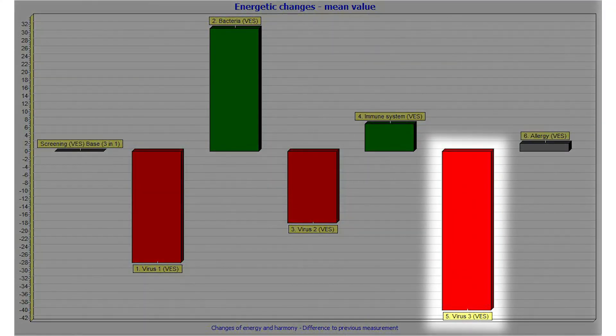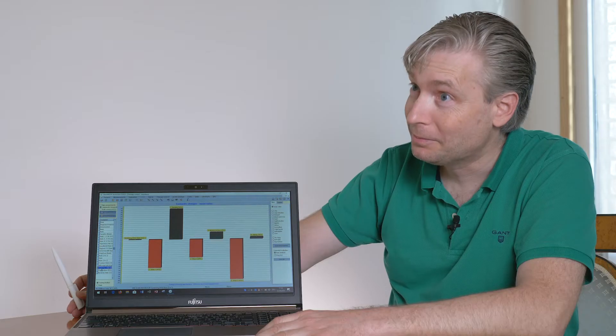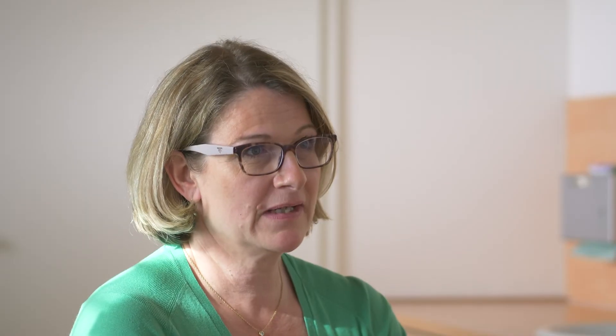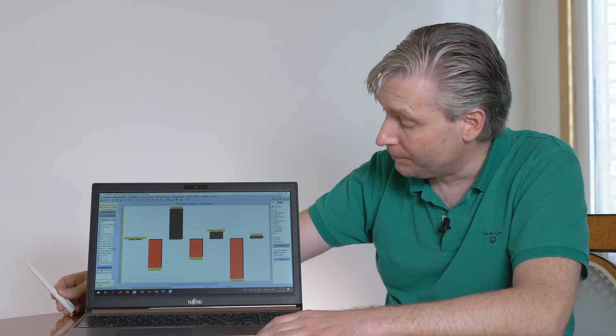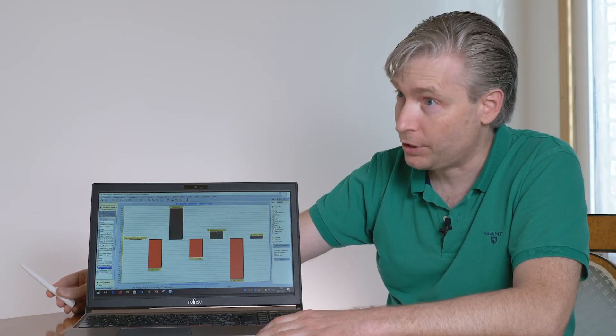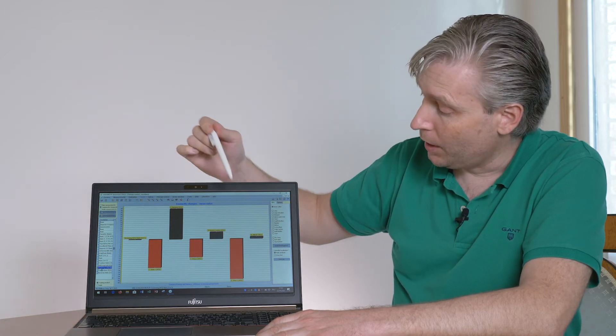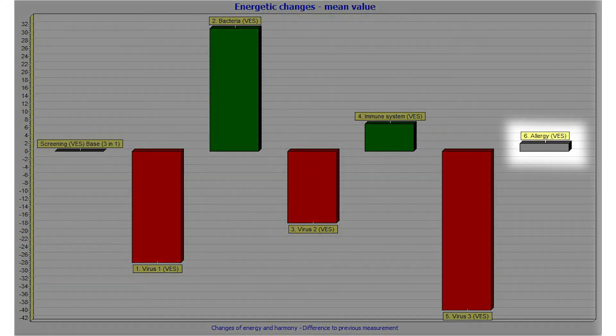This bar represents COVID-19. And you're really lucky. You are. It is deeply red and below the baseline. Which means negative. Obviously no infection with SARS-CoV-2. Last but not least, there are no problems with any allergic reactions.